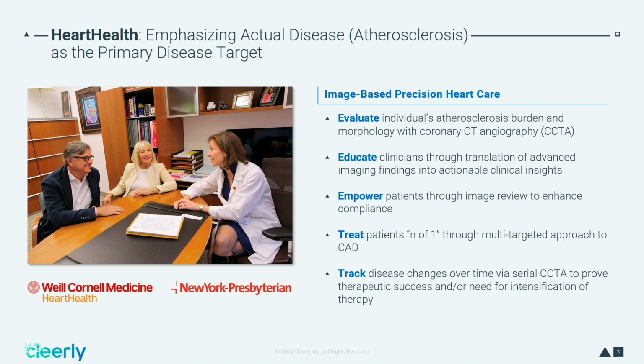And obviously, this field, together, collectively, we've learned a lot over the last 2 decades. Based on what we had learned, about 12 years ago, my friend Erica Jones, you see her in the middle there, and I started a program called Heart Health, really leveraging coronary CT angiography, similar to the way you'd use another non-invasive imaging tool for early detection of disease.